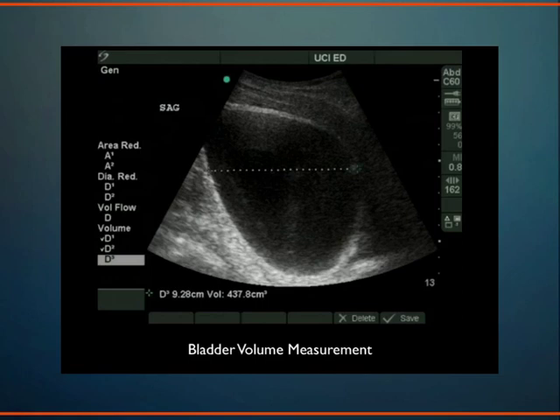But just to measure the urine, there's also something called a post-void residual. Somebody who has an enlarged prostate thinks they've emptied their bladder, but instead we have 400 cc's left in the bladder after they attempt to void. Their post-void residual, 400 cc's, is a lot of good information to pass along to a specialist like a urologist. And we can also measure their prostate too on bladder.